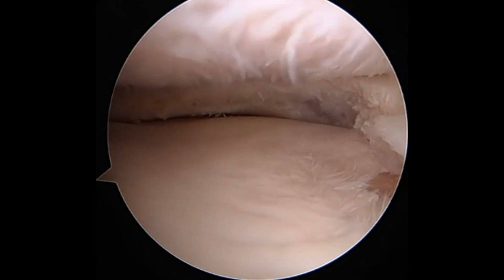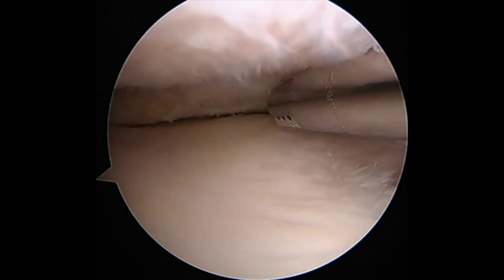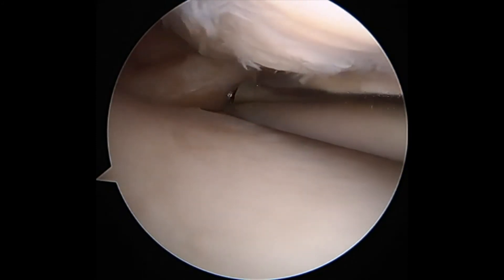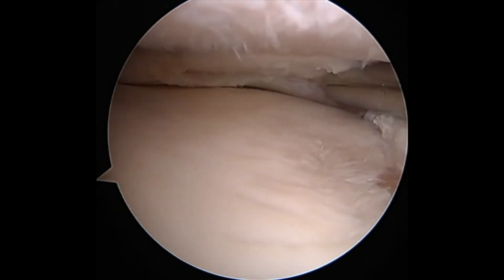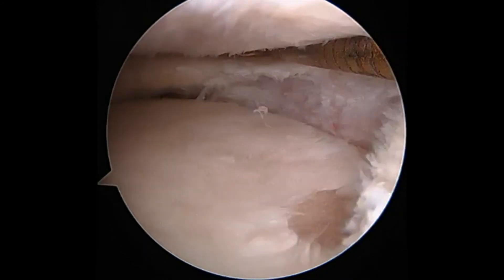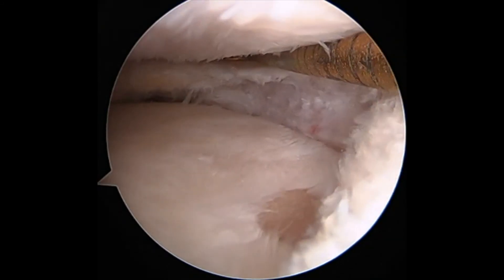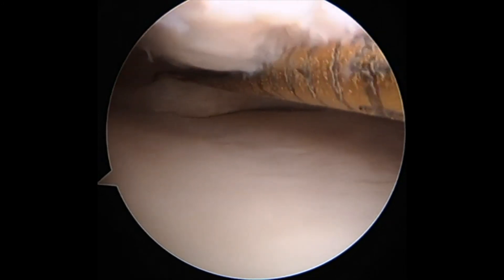Once I use the meniscal biter to remove the torn portion of the meniscus, the next instrument I place in the joint is a shaver. The shaver is used to remove any meniscal fragments, and can also be used to remove any free meniscal edges not removed with the biter. As you can see here, I'm running the meniscal shaver along the torn meniscus in order to smooth it out and remove any rough edges. Following removal of the torn meniscus, I will often place my probe back in the joint to further probe the meniscus. At the end of this surgery, I want to make sure that all torn meniscus has been removed and only smooth meniscus edges remain.